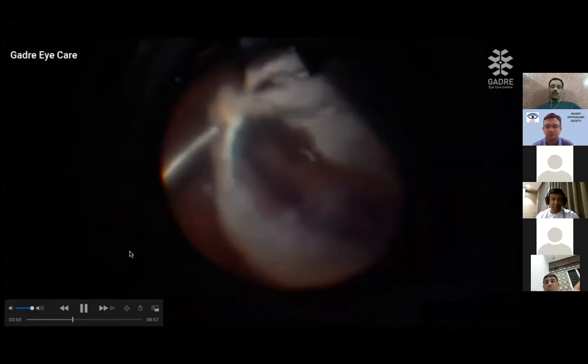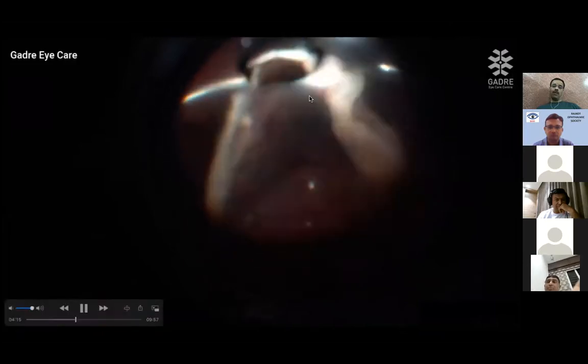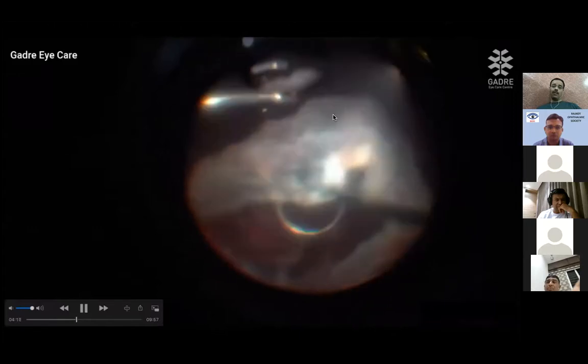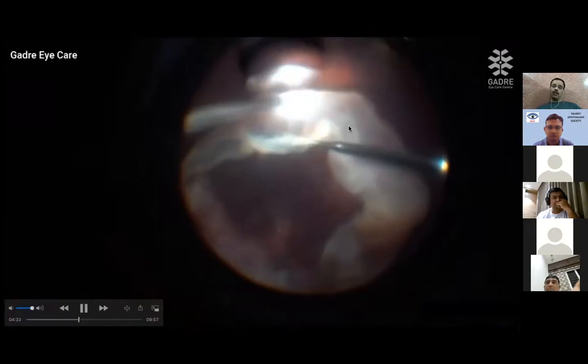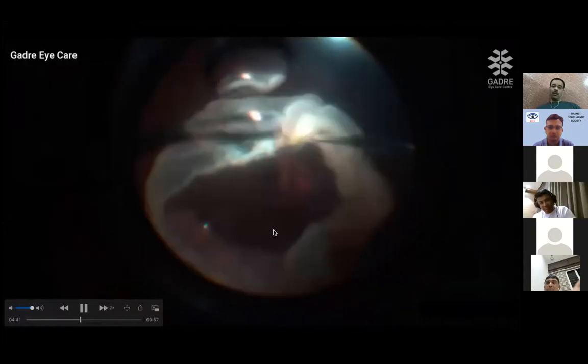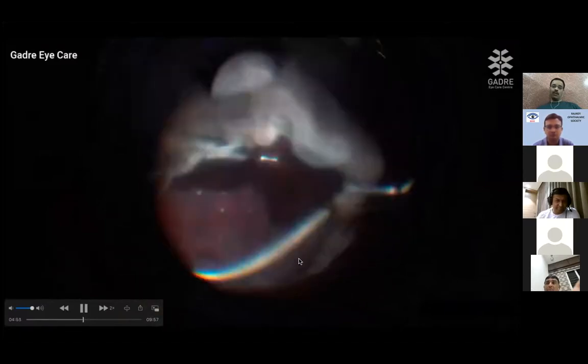The next part was these transverse membranes that were holding up the retina in a purse string form, preventing it from opening further. So I decided to loosen the purse string by stretching the fibrosed part of the retina there. This was done about 270 degrees, since the nasal convolutions that you note are much more. The temporal part is a bit more open. Gradually even the anterior purse string started to open. And it was again repeated nasally, inferonasally, and superonasally.